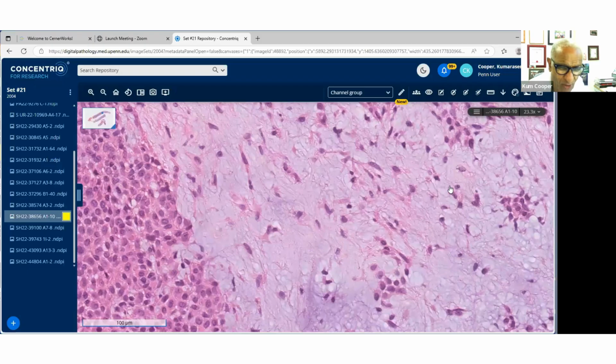And so, as you know, the salivary gland myepitheliomas may carry a PLAG1 gene rearrangement, carrying a fusion, as well as HMGA2. So this was PLAG1 rearranged, just to confirm that it is a soft tissue myepithelioma. So any questions or comments on that?